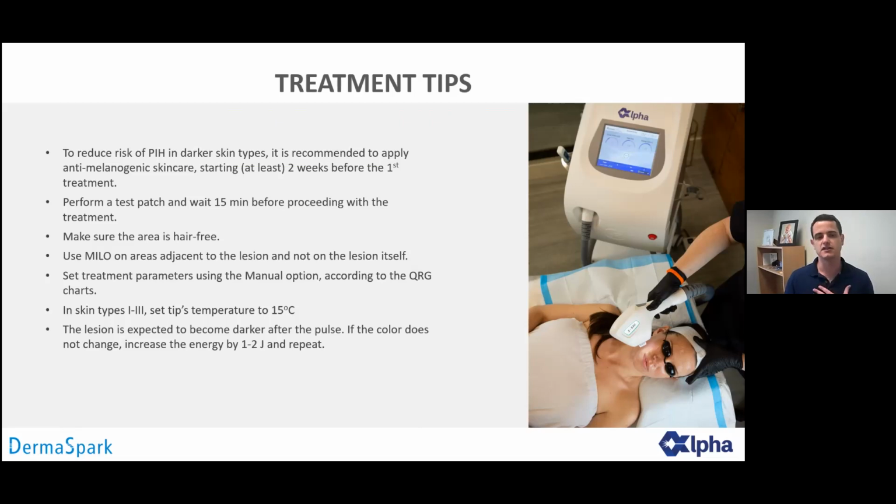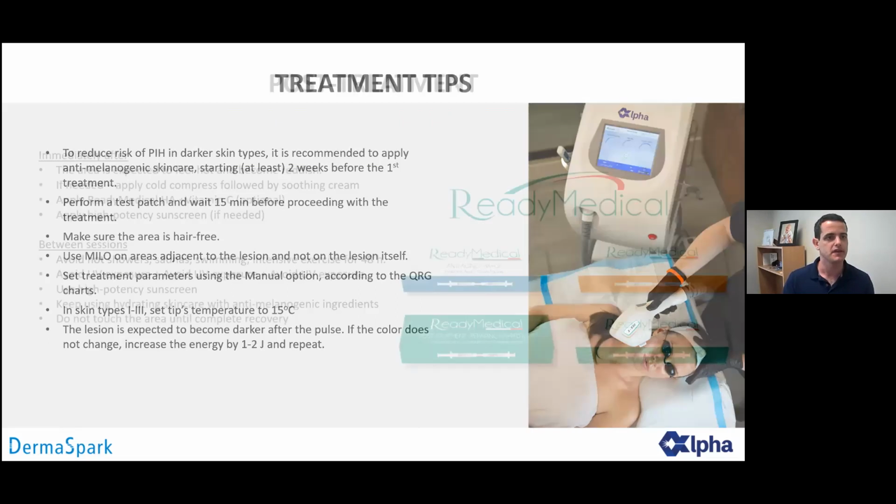And as I said, the lesion is expected to become darker after a pulse. And if the color does not change, increase the energy by 1 to 2 joules and repeat 1 more pulse. Okay, so practice that and you will get better results with your alpha.